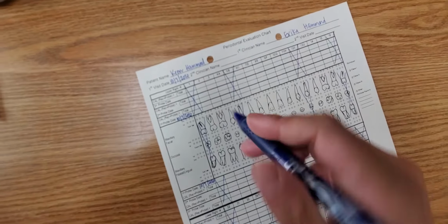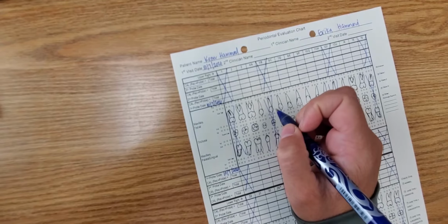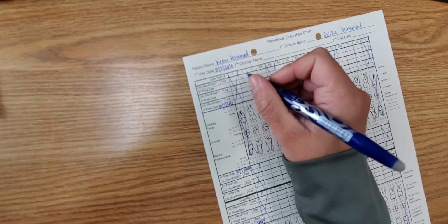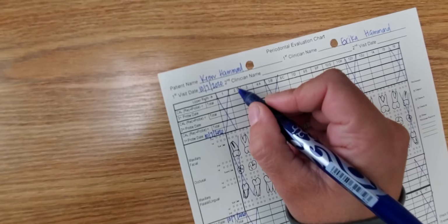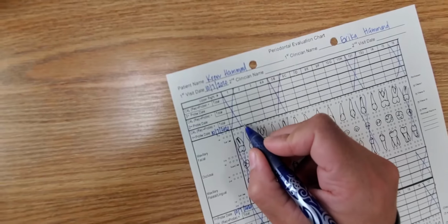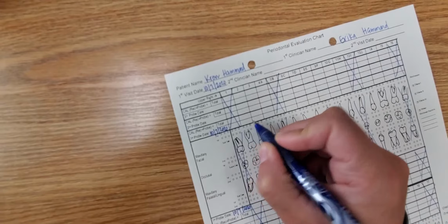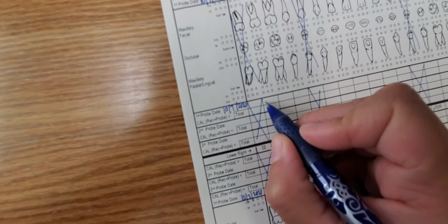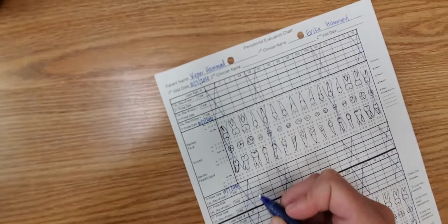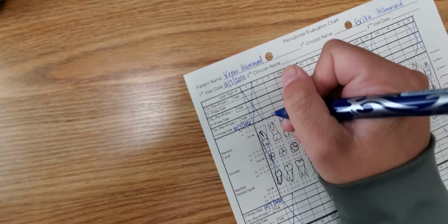So let's say you're beginning just as normal, wisdom teeth and first premolars are missing. You'll tell your recorder, I'm going to start on tooth number 2. There's 3 numbers in each box, so you're going to have your distal buccal reading, your straight buccal reading, and your mesial buccal reading. On the lingual, you'll have your distal lingual reading, your straight lingual reading, and your mesial lingual reading.